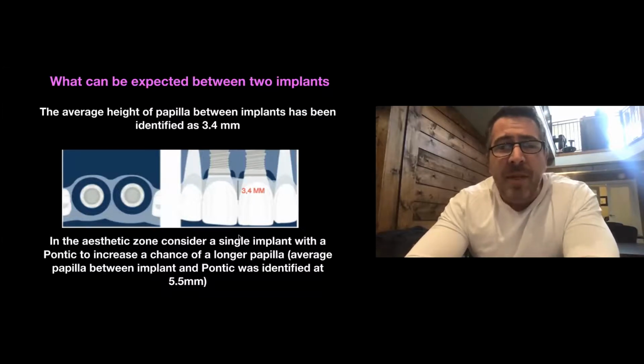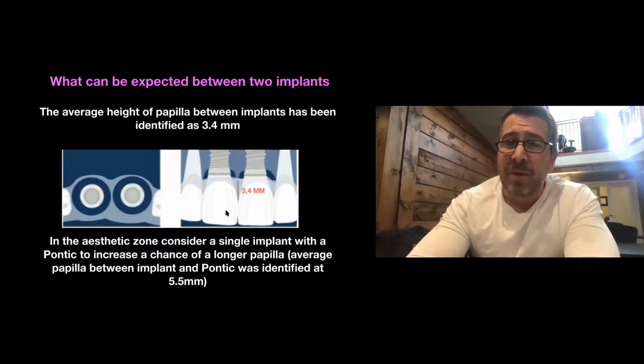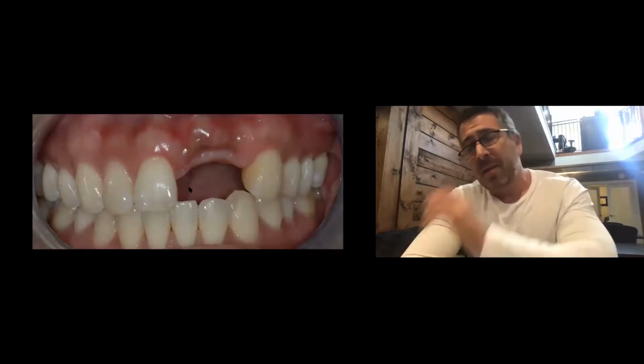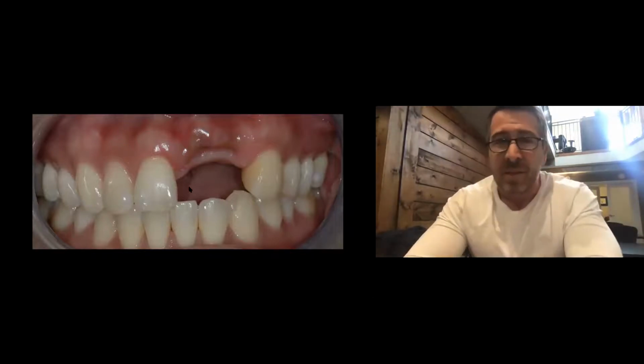So sometimes in the aesthetic zone, I'll consider a cantilevered prosthetic because I can create a nicer papilla with a pontic than I can between two implants. So let me show that to you. This is a young girl who was in a snowboarding accident in Whistler. Actually, it was her boyfriend's fault. They got off the lift and his snowboard came up and smacked her in the face and knocked her teeth out and took part of the anterior maxilla out.